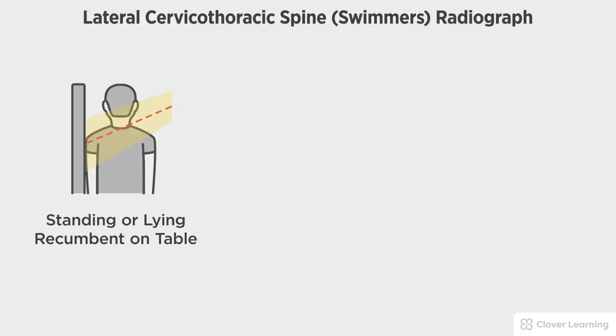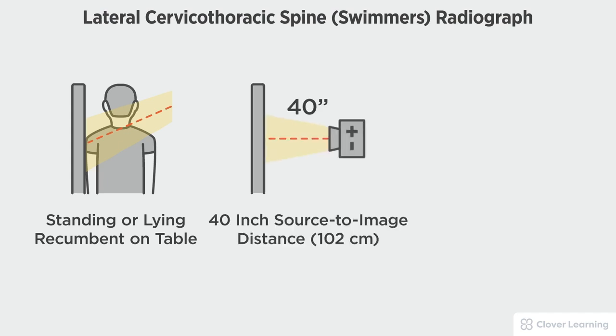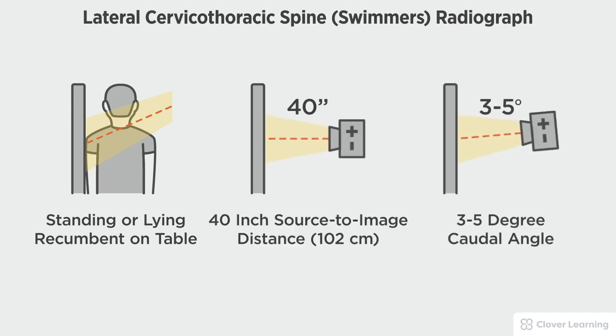In this view we will be demonstrating the lateral cervical-thoracic spine, or swimmer's view. The lateral swimmer's cervical-thoracic spine should be performed with the patient standing at the upright Bucky or lying on the table, a 40-inch source to image distance, and if needed a three to five degree caudal tube angulation.